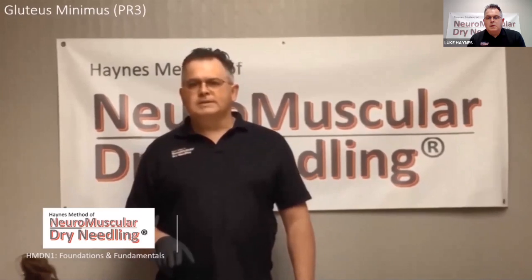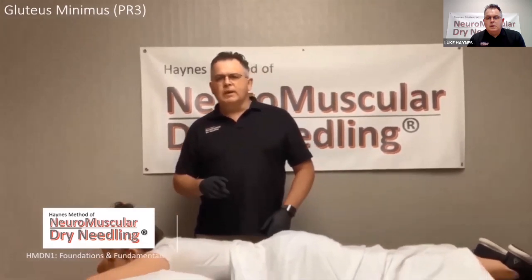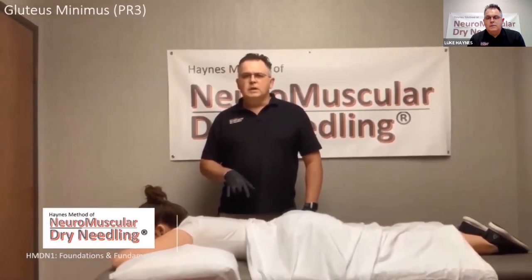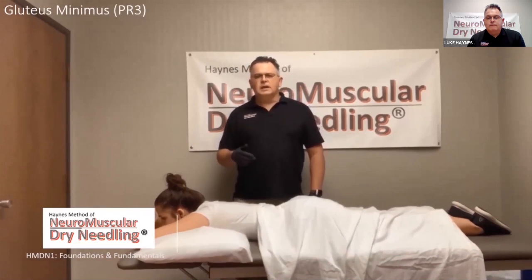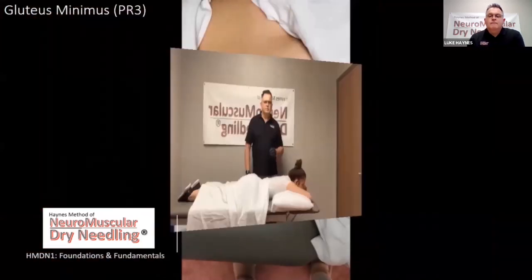For the gluteus minimus, the patient again is going to be in the prone position. Needle length is 40 to 60 millimeters, and the backdrop is going to be onto iliofemoral ligament. We're going to palpate the apex of the greater trochanter and the iliac crest. We should palpate the IT band along this path. And we're going to insert a needle at a midpoint between the iliac crest and the trochanteric apex in a lateral to medial direction using the iliofemoral ligament as a backdrop.